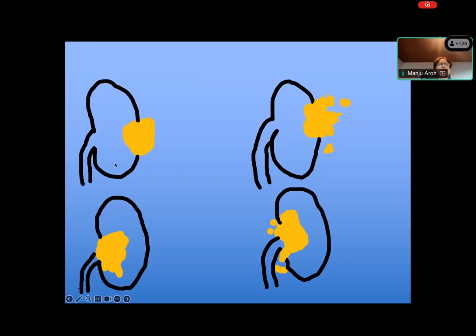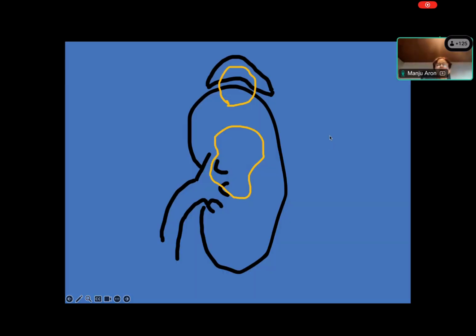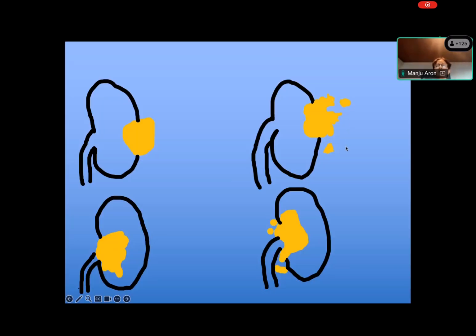You can see here to your left, you have this tumor which has a nice smooth interface with the perinephric fat here. This is an exophytic tumor which is protruding in the fat. Here's another tumor which is more central in location, but it has again got a very smooth interface with the renal sinus fat. And then you have tumors like this where the interface is irregular. And then you have these discrete nodules further out in the perinephric fat. Or here the central tumor again, you can see it's irregular, and then you have these circumscribed nodules that you see in the renal sinus fat.